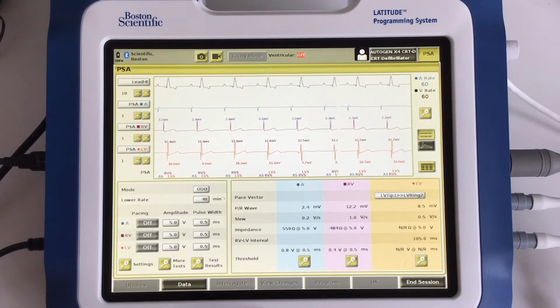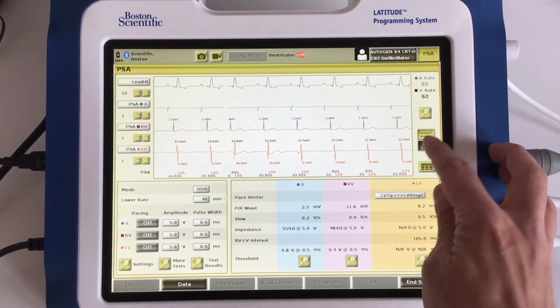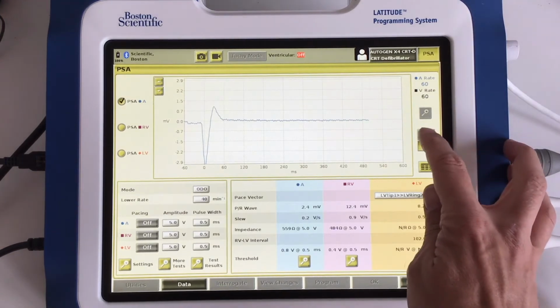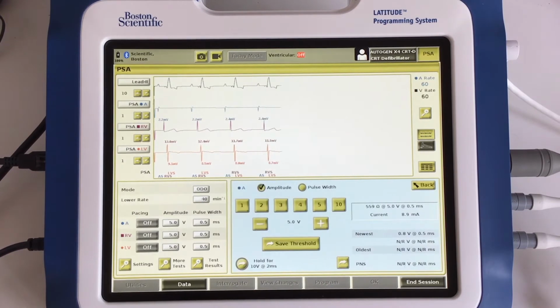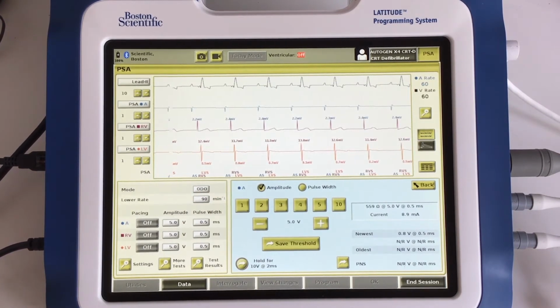We can look at our injury current, and as we're checking A, we select it here and see the injury current updated beat to beat. Going back to the lead trace display, we perform our A lead checks in here, increasing our pacing rate and coming on to pacing.